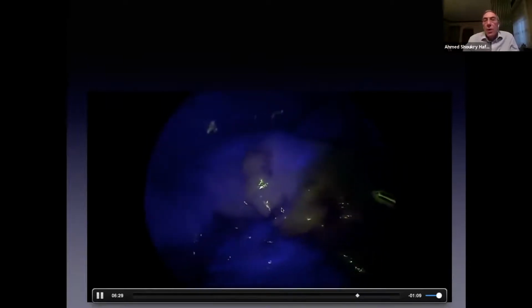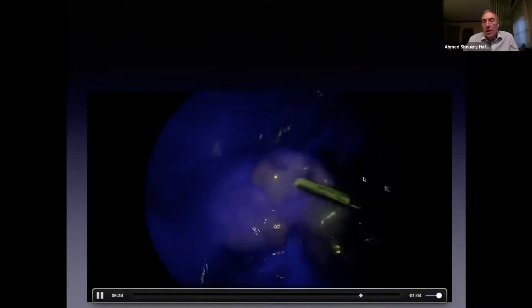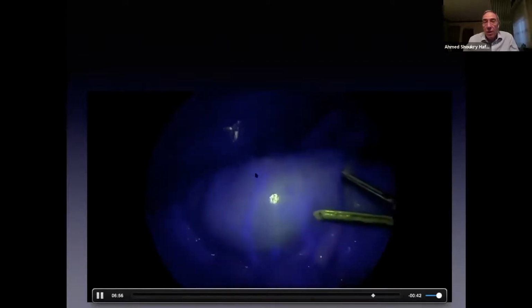And you will see that at the point where we have transected the mesentery, this is the transitional area, the demarcation line between the vascularized and non-vascularized colon. And as Colin and Andreas have shown, you need to see the vessels glowing. This is the deep vascularized part. Here you don't see any vessels, but here you see the branches of the vessels filled with the ICG.